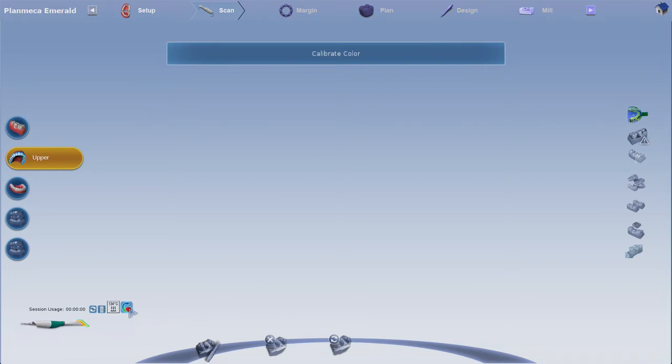If the color models are not as vibrant as they used to be, we recommend that you color balance your scanner.